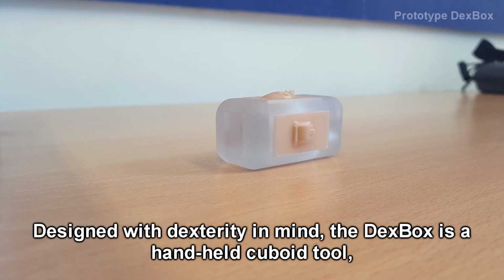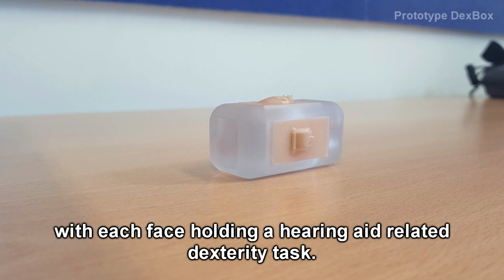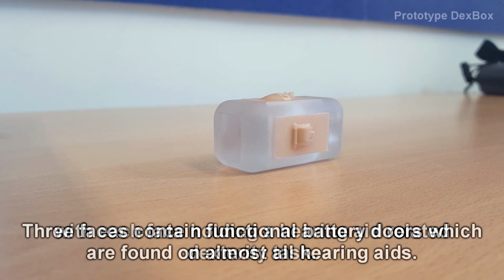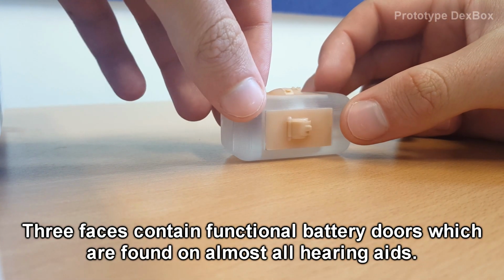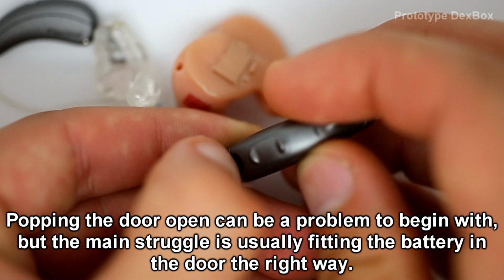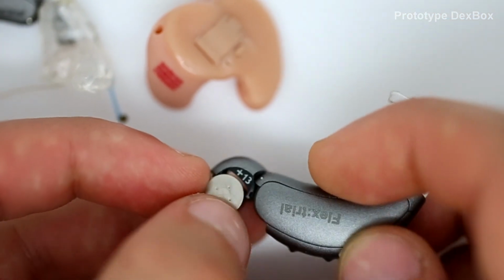Designed with dexterity in mind, the DexBox is a handheld cuboid tool, with each face holding a hearing aid-related dexterity task. 3 faces contain functional battery doors, which are found on almost all hearing aids. Popping the door open can be a problem to begin with, but the main struggle is usually fitting the battery in the door the right way.